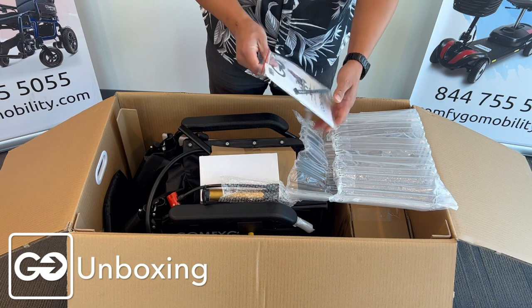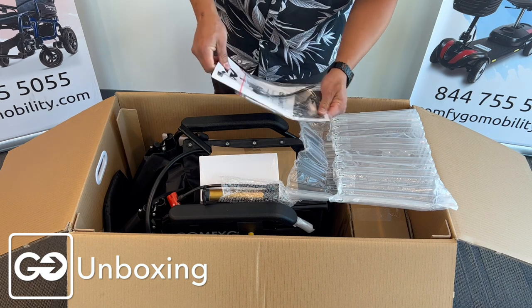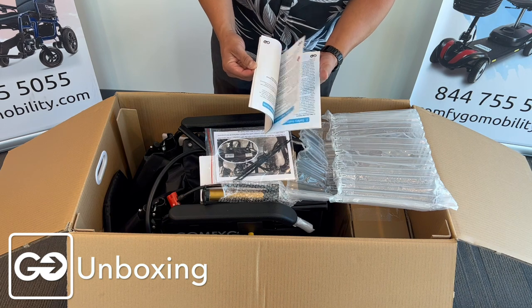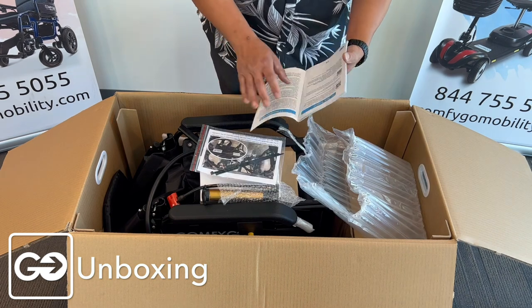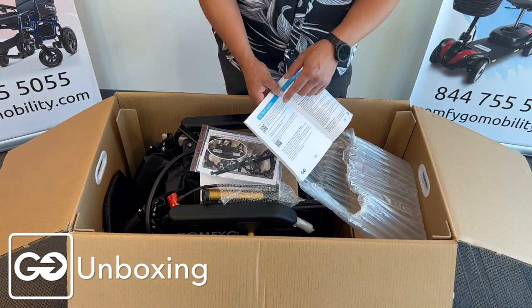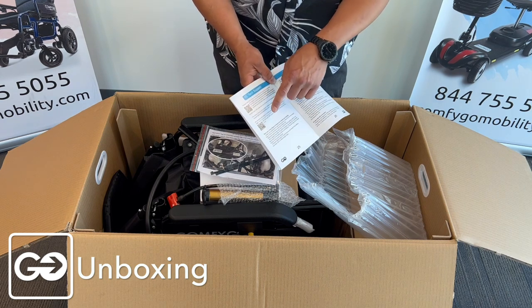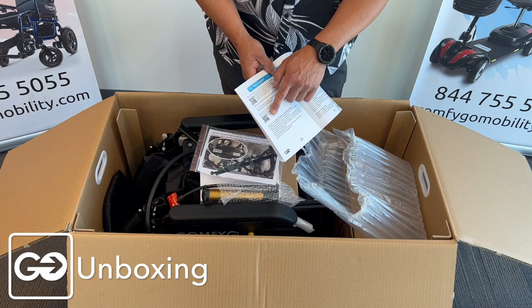We have a couple of tie straps and our product manual book in here. There's some important information here that you always want to refer to when you're putting your chair together. On page 25 of this product manual, you have two QR codes — one for registering the product and the other for warranty information.